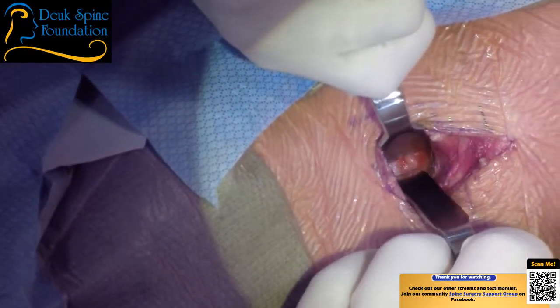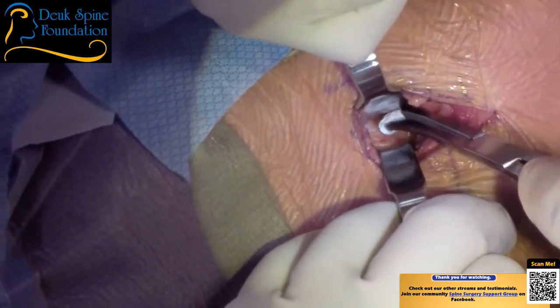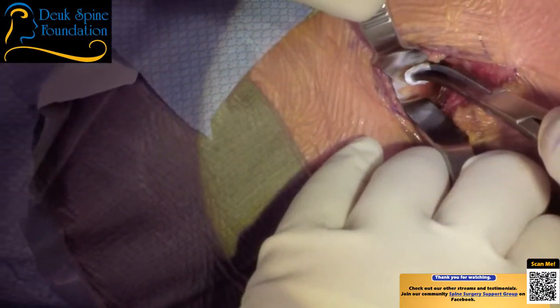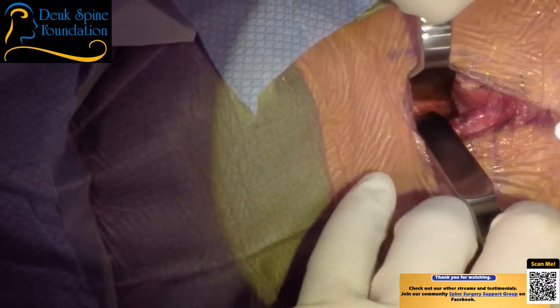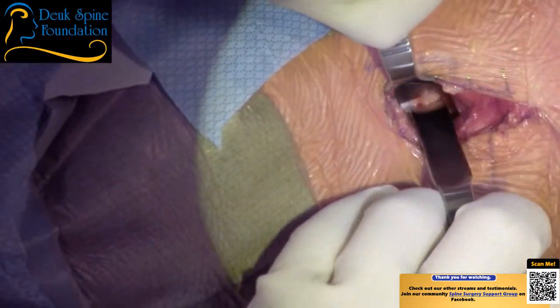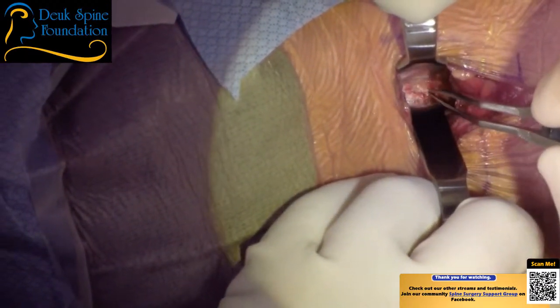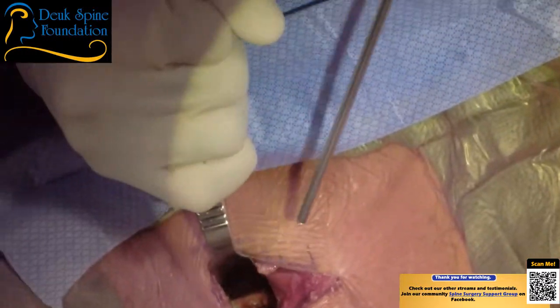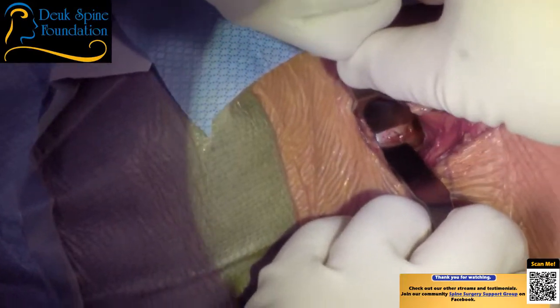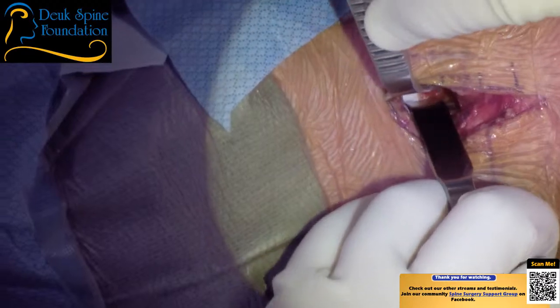All right, kitty. There's a little bit of fat down here in the retropharyngeal space. I can see the discs. There's the first disc. You all see that, Sean? Yes, we do. Okay, good. The only problem is we don't know which disc it is, so that's why we need the x-ray machine. Bipolar? So we're going to use the x-ray machine in a minute to figure out what disc that is. We want to make sure we operate on the proper disc. That's C6-7. I suspect that's either 5-6 or 4-5. So we'll find out in just a minute.